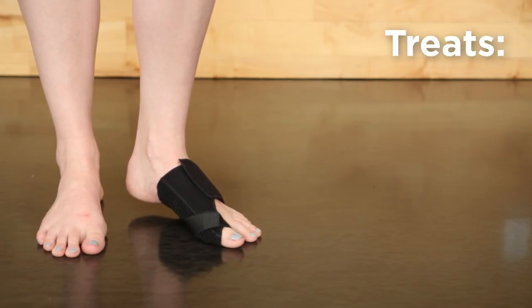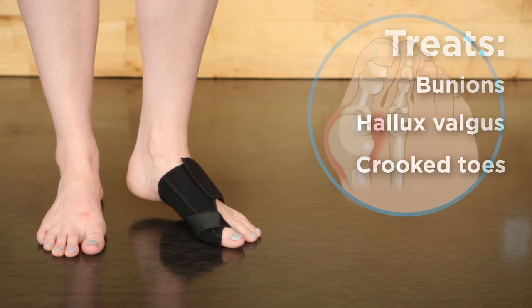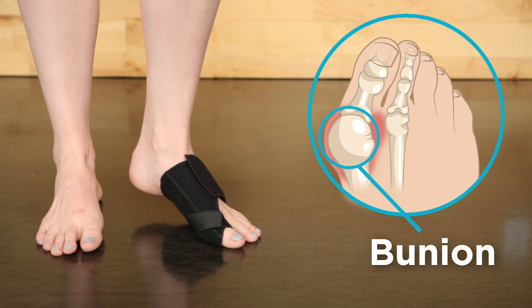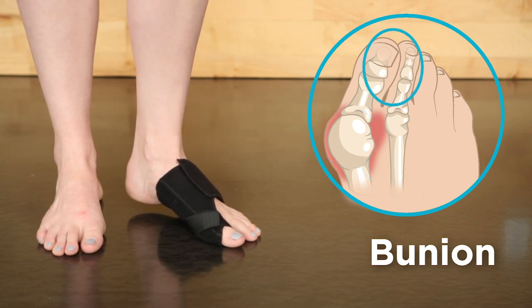Braceability Splint eases discomfort and pain caused by bunions, hallux valgus, and crooked toes. A bunion is a bony bump on the joint at the base of your big toe, forming when your big toe pushes against the next toe.